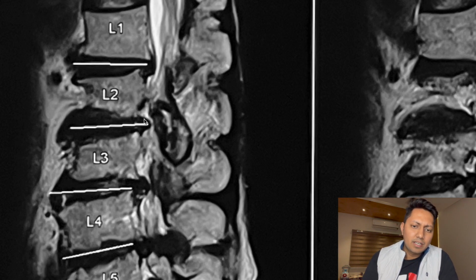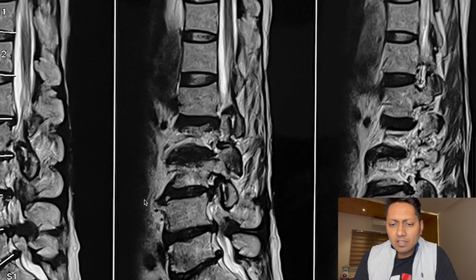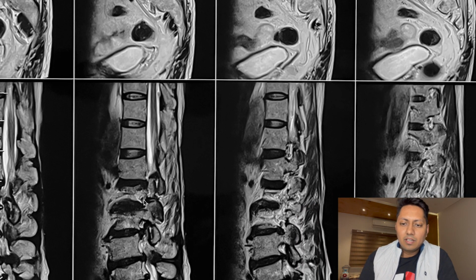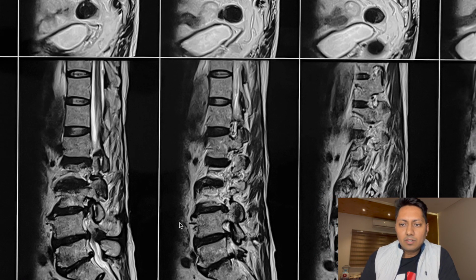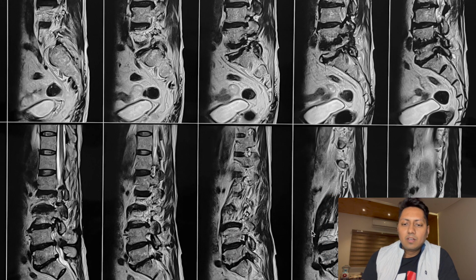Now you may say that he has a multi-level disc at L1, L2, L3, L4 and S1, and he may need a multi-level decompression, but clinically I feel he has L4 and L5 only right-sided symptoms, so my targets are just those two nerve roots, and I'll try to decompress just those two nerve roots only.